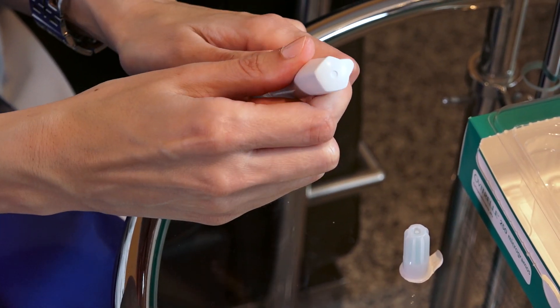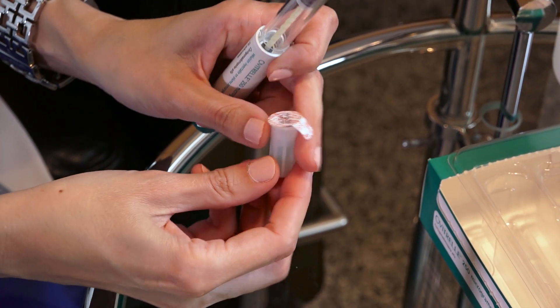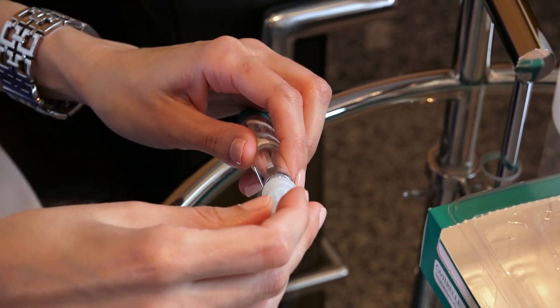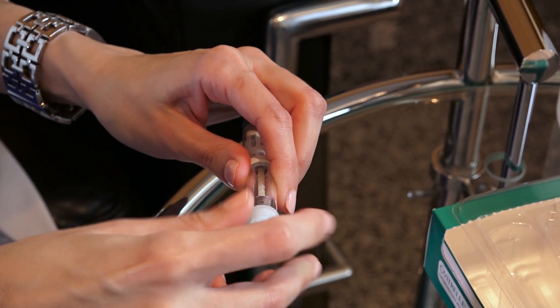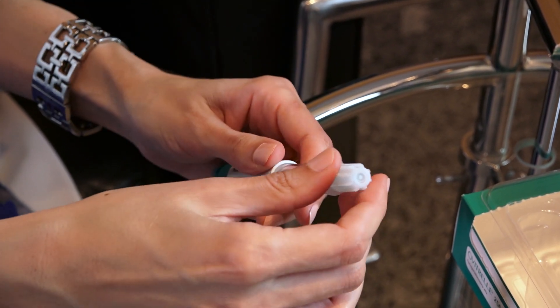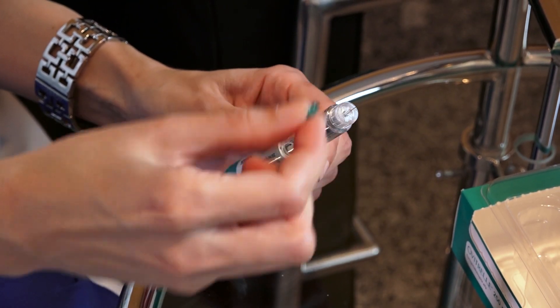Remove the rubber cap from the syringe. Remove all the wrapping from the needle and position the needle on the syringe.